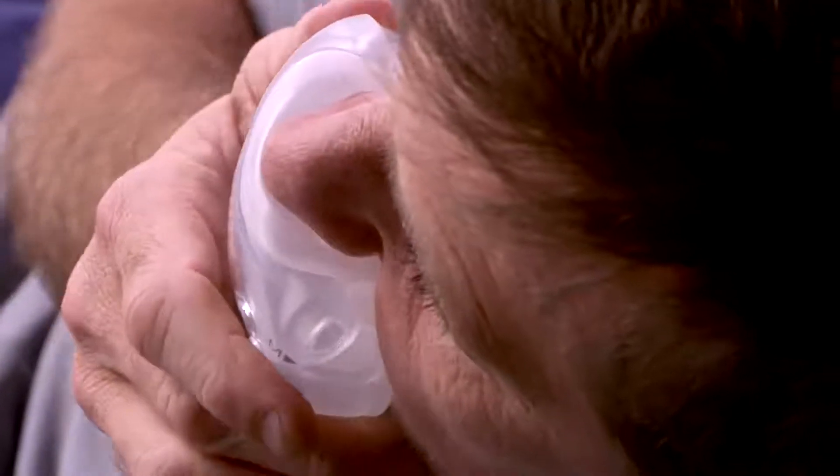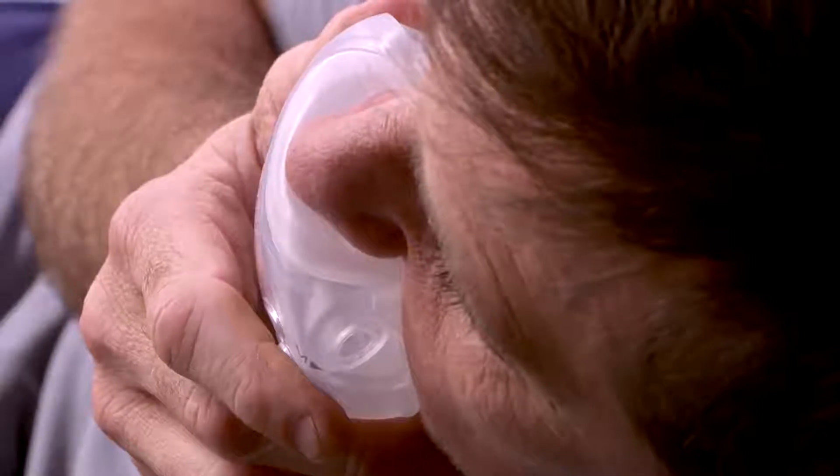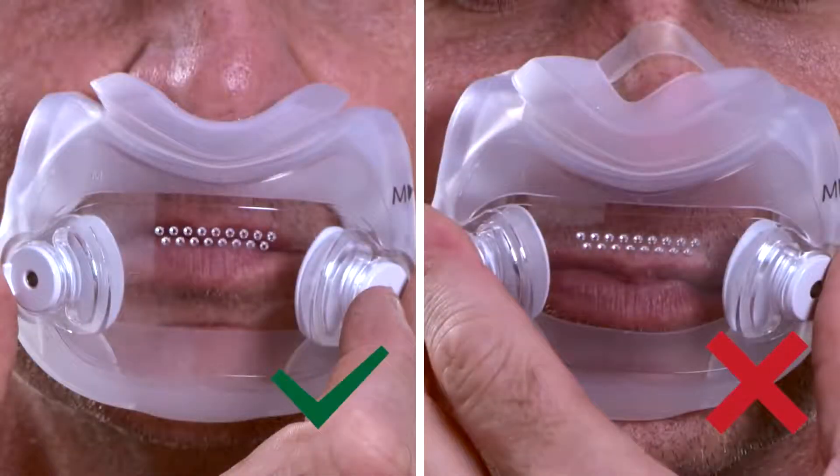Hold the cushion up to your face. The cushion opening should be directly under your nostrils and the cushion should hug your mouth and nose. If your nose is inside the opening or if any part of the cushion overlaps your nose, the mask is being worn incorrectly or you may need a different size.